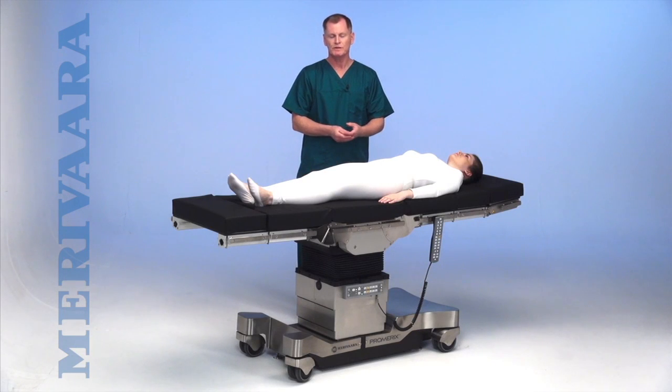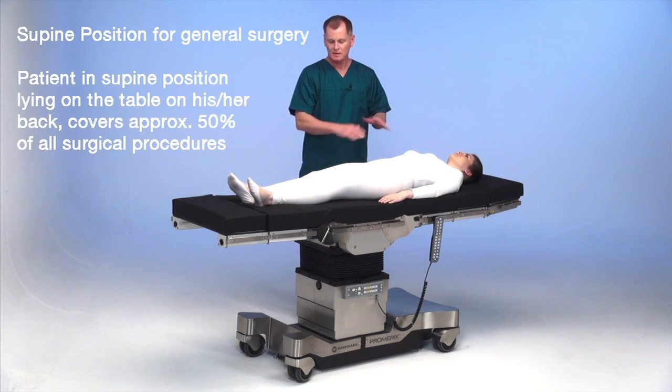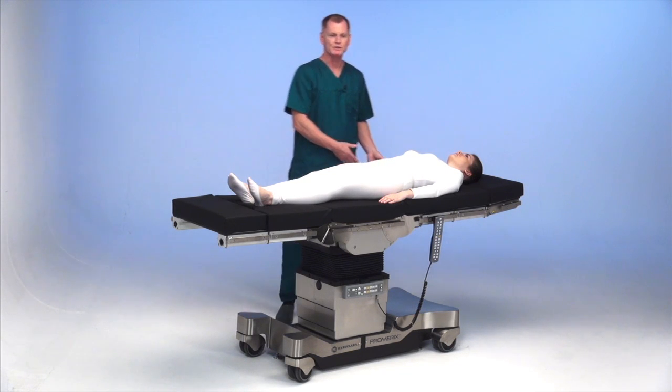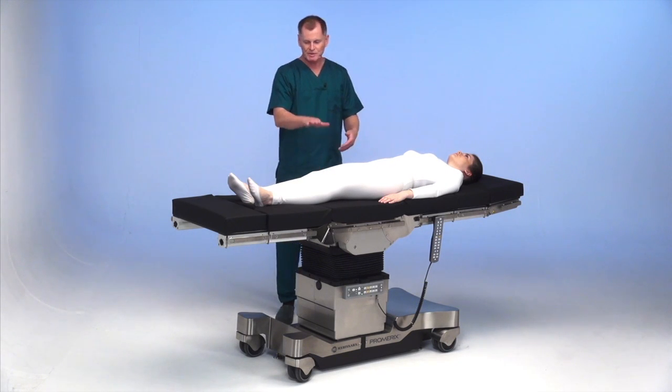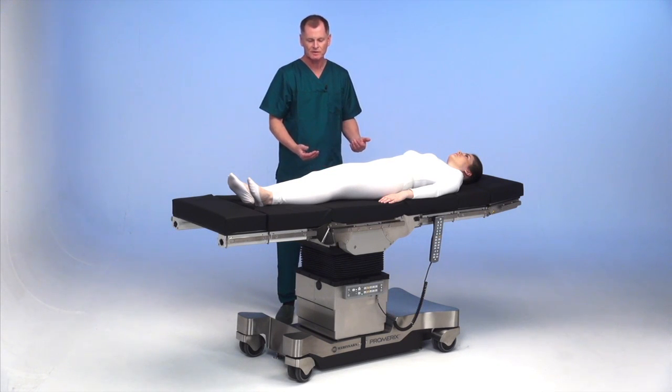The patient is in the supine position, which accounts for about 50% of all surgical procedures — the patient lying on the table on their back. The armboard is placed on the opposite side for patient transfer. The table should be set at the height of the gurney to have a safe transfer. Once the patient is on the table and the gurney is taken out of the room.